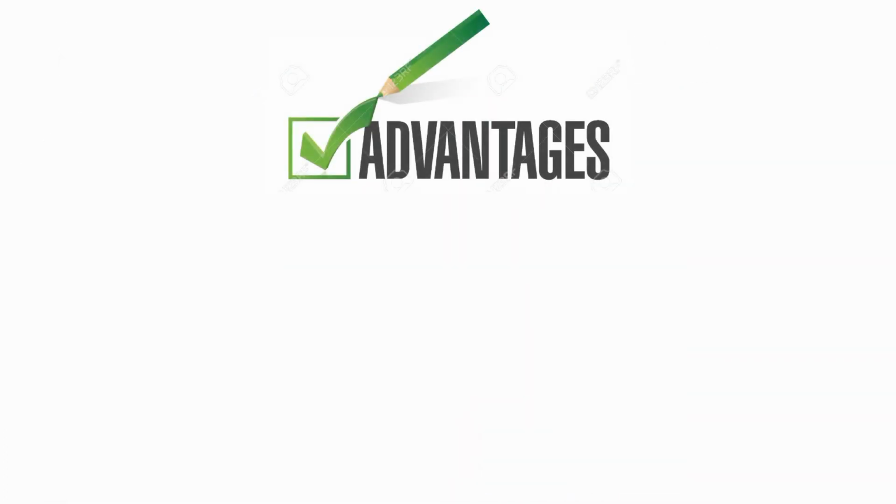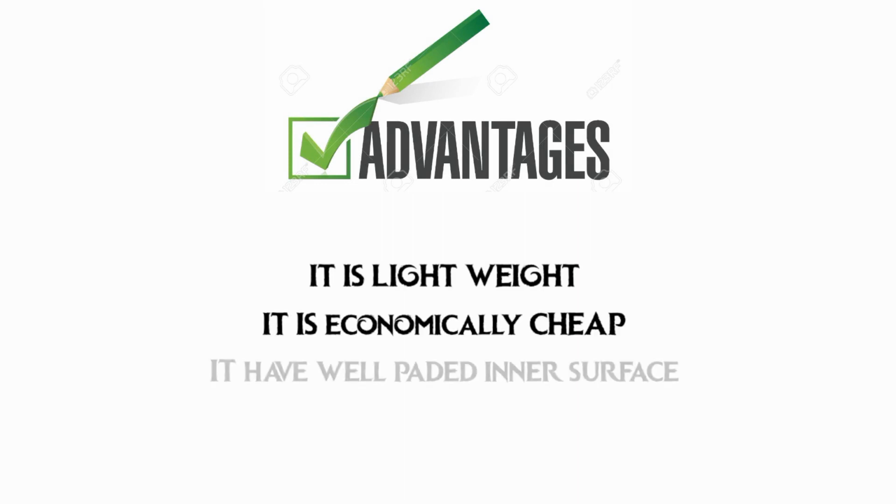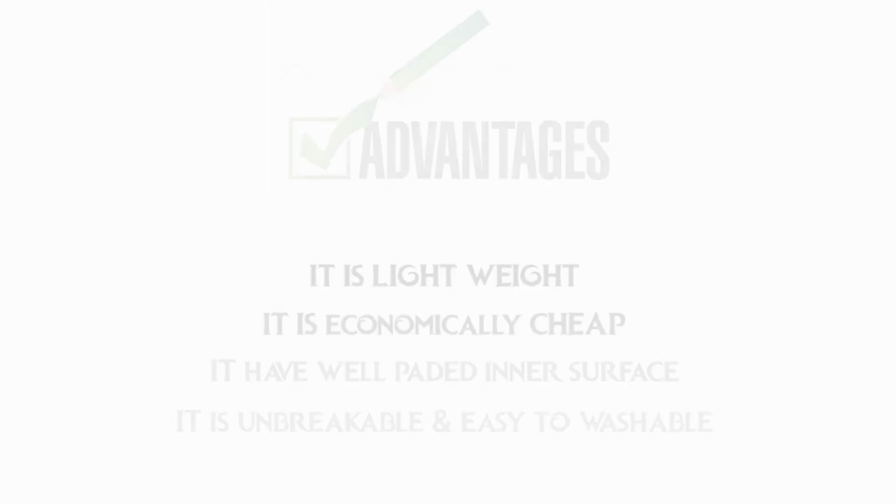Advantages of the wrist Cockup splint. It is lightweight and it is economically cheap. It has a well padded inner surface for patient comfort. It is unbreakable and easy to wash.